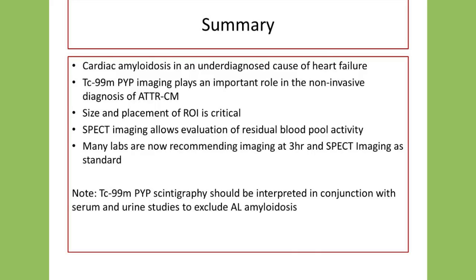SPECT imaging certainly allows for better evaluation of the differentiation between what is residual blood pool activity and what might truly be myocardial uptake. So ensuring that you are scanning long enough after injection to allow for appropriate blood pool clearance is why many labs are now recommending that imaging happen at 3 hours, and that SPECT imaging is now becoming standard, not optional.